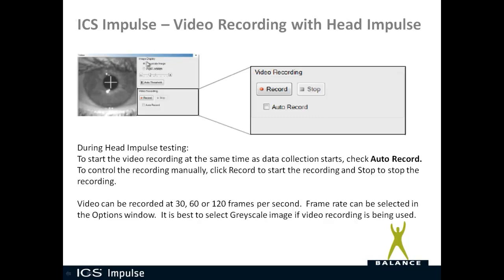Over here in this screen, you see when you're doing data collection, you have the option of grayscale image or pupil location. Pupil location will be a white pupil and a black background, so grayscale image will actually give you the full picture. So it's obvious that grayscale image is the option you want to choose.